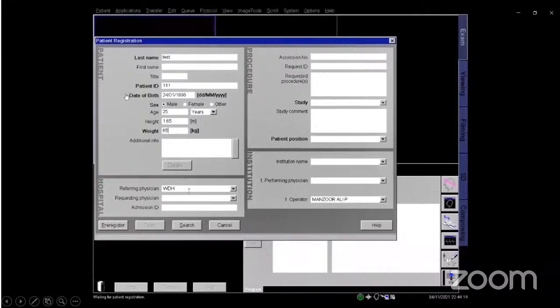We can see all the bolded areas. All the bold-written areas are needed to start the scan. Until we complete them, we won't get the exam option.